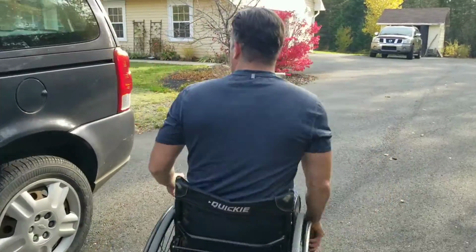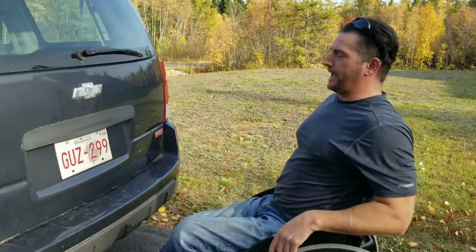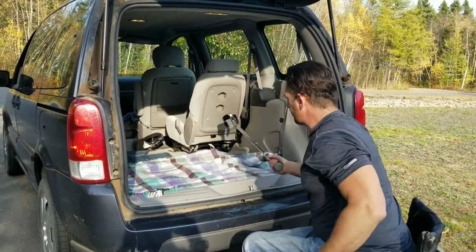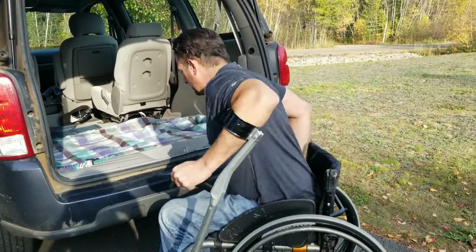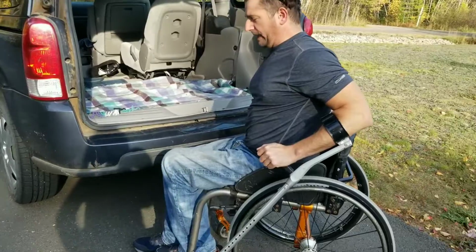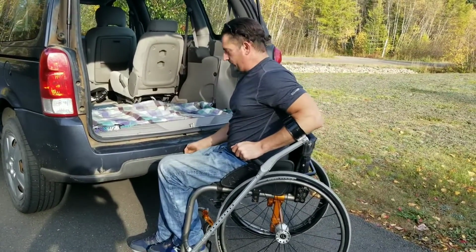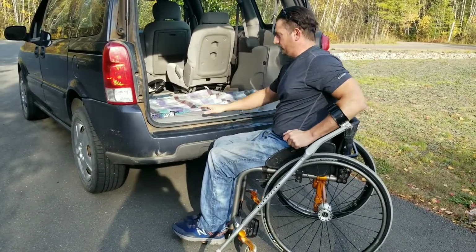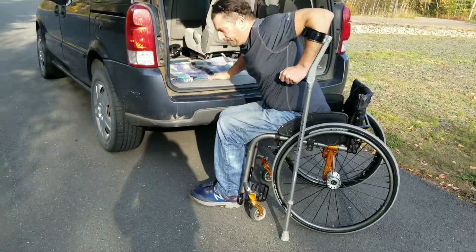But here in the van, so what I would do is to put it in the back, I'd have my forearm crutch, and it's really quick, easy. I just basically put a brake on, angle my chair, so if I am on a slope, I am like right now, and when I did get up, if my brake wasn't on, the chair would move into the van and not scoot down or hit me in the back of the legs and make me fall over. So I grab on something firm, have my forearm crutch like that, push up.